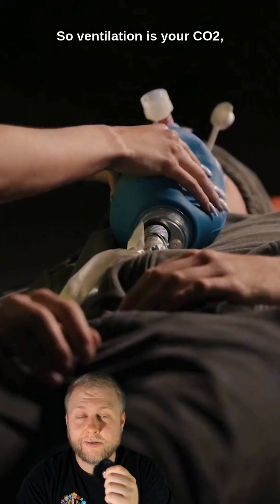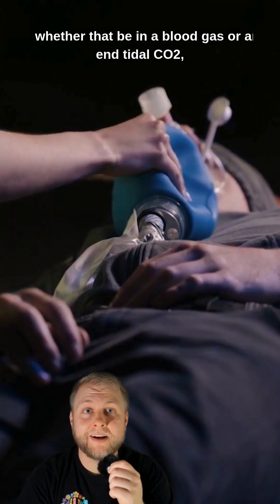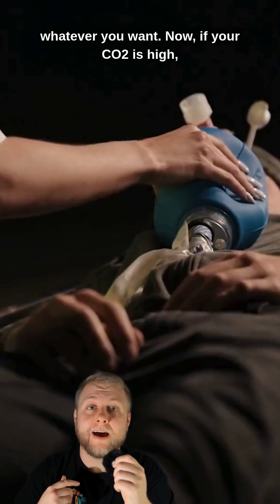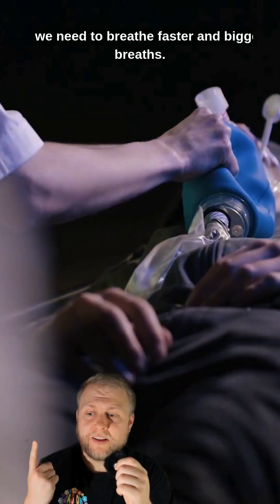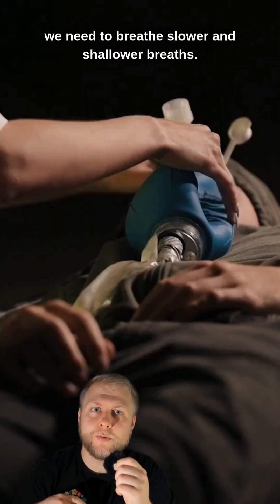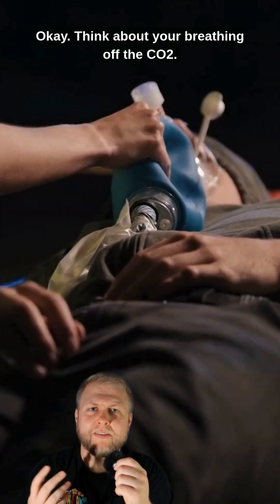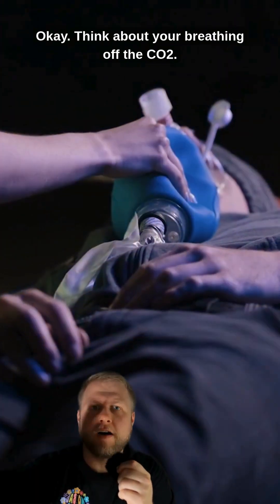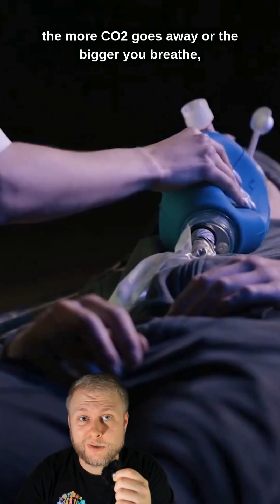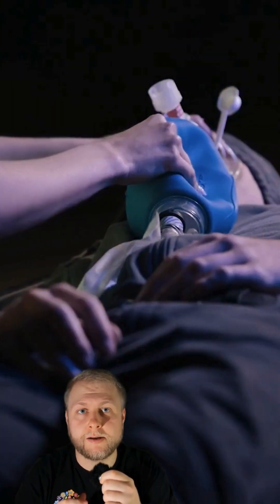Now let's discuss ventilation. Ventilation is your CO2 — whether that's from a blood gas or an end-tidal CO2. If your CO2 is high, we need to breathe faster and bigger breaths. If your CO2 is low, we need to breathe slower and shallower breaths. Think of it as breathing off the CO2 — the faster or bigger you breathe, the more CO2 goes away.